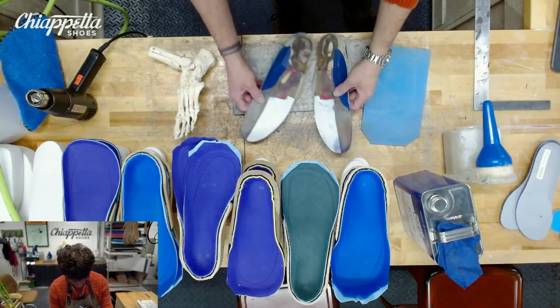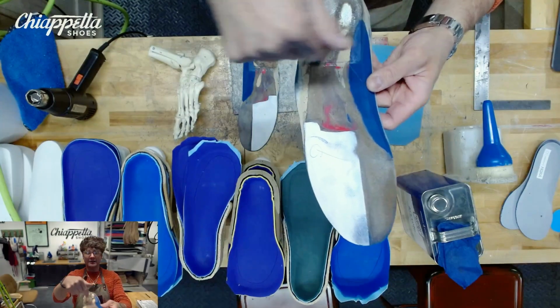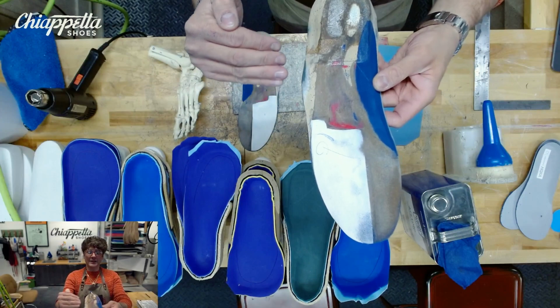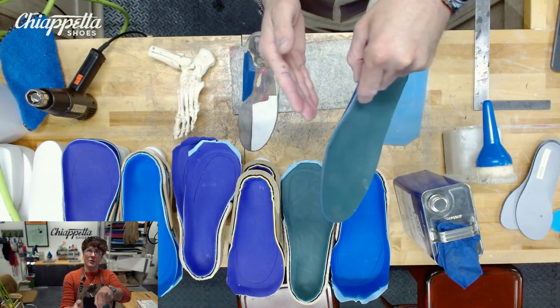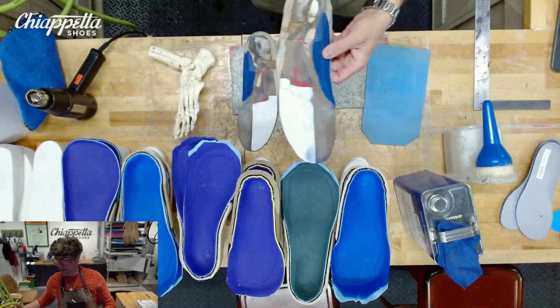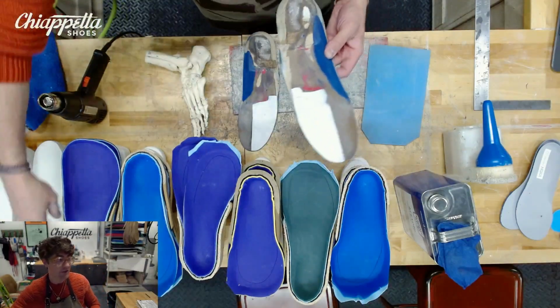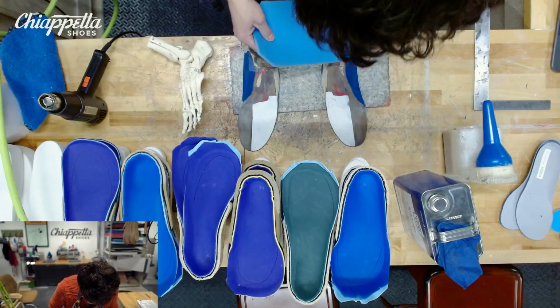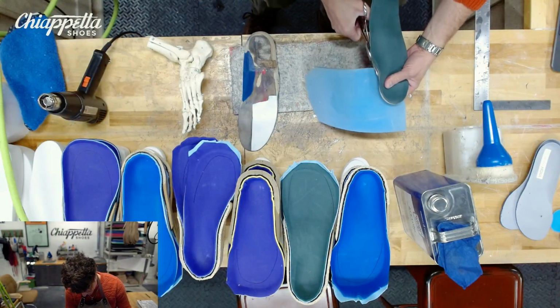And look at, we had a lot going on down the middle. We had a longitudinal arch bar. We had a calcaneal bar or an arch bar down the side. We had a lateral heel wedge. So we're leveling that all off. We're actually softening the arch up because I think even the standard amount was tilting more to the outside, so we're softening that up. Adding a little heel cushion, keeping the lateral forefoot wedge. I think that is still what I would consider an accommodative measure when we're dealing with this forefoot wedge. So we're not doing any correction at this point in the game. The only correction that we're offering is this extra heel height.